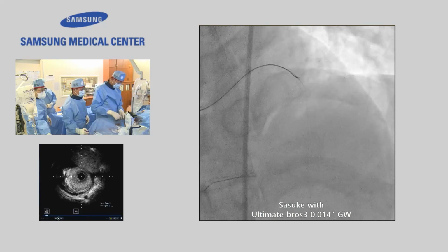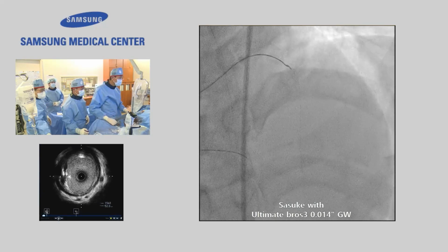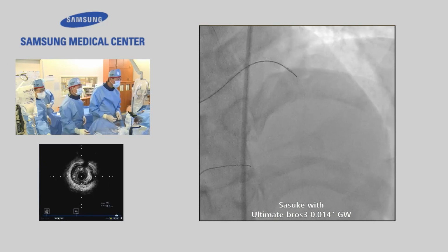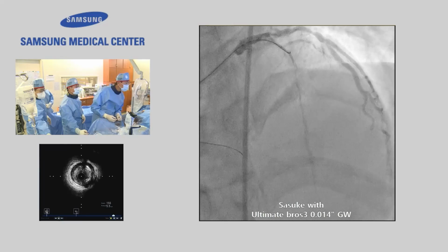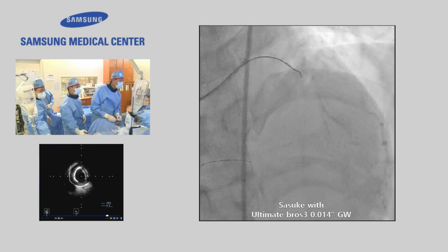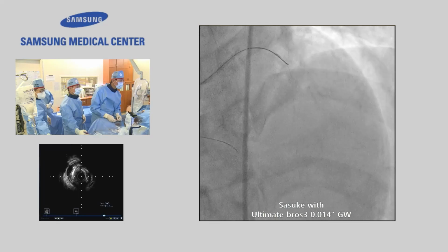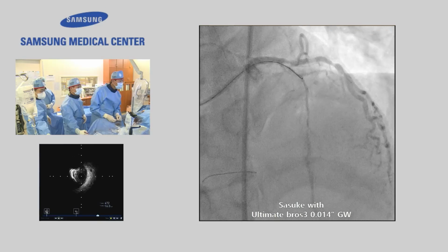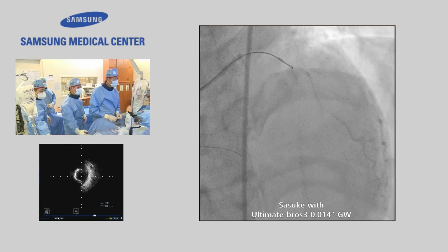Pull back a little. Okay, test. A little more distal. More distal. Test. We can see some, yeah. Okay.